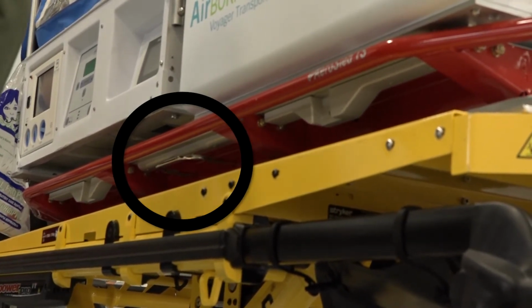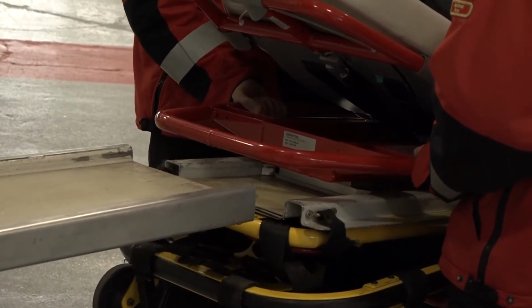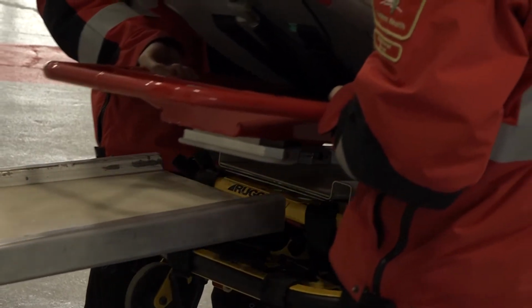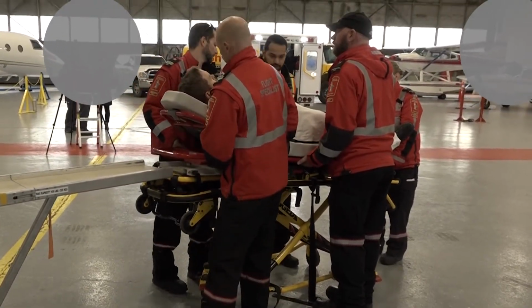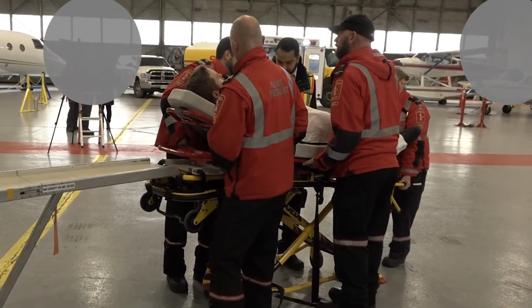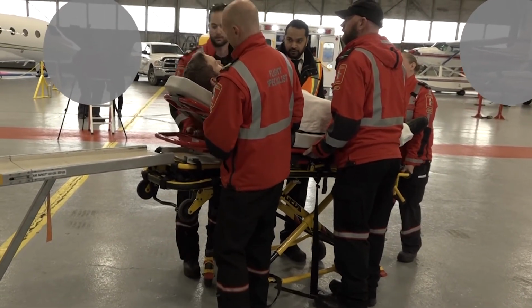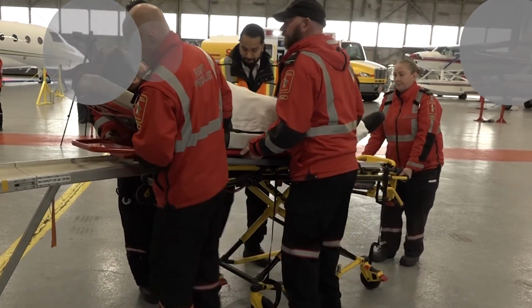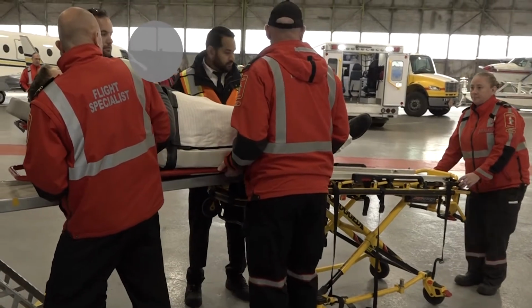8. When directed, the 2 individuals at the head of the stretcher will pull in the handles under the middle of the aerosled to retract the clips and free the sled for movement. These 2 people then lift the aerosled approximately 2 inches to free the sled from the clip deck, while all 4 people laterally move the aerosled onto the lift platform. The in-charge person will communicate with the staff when alterations to the aerosled's positioning is required, i.e. shifting it to the side or lifting higher.